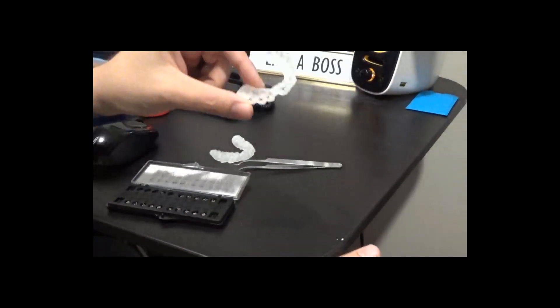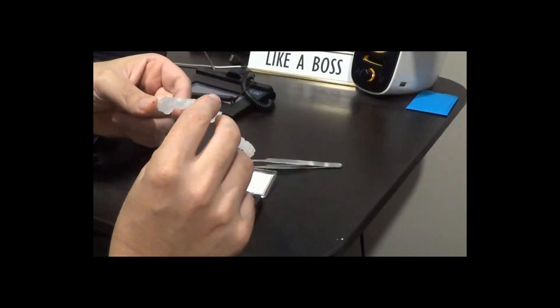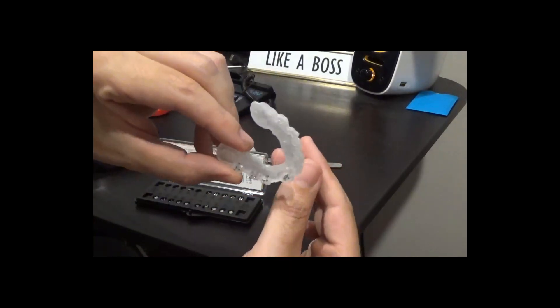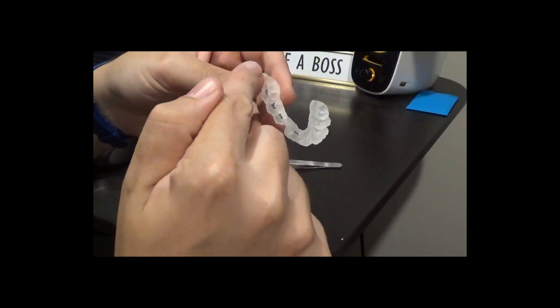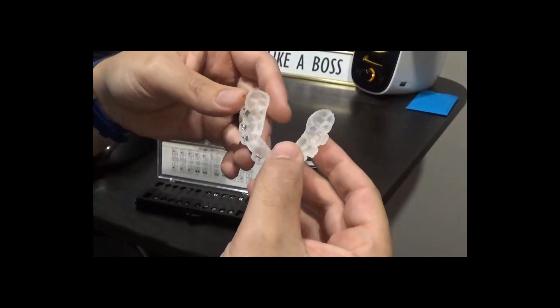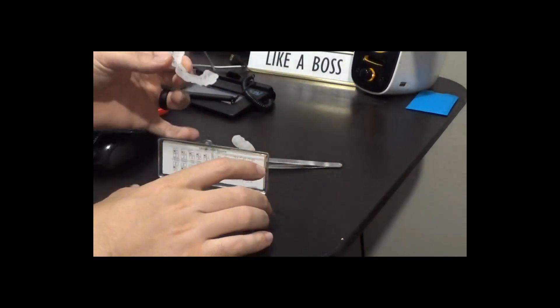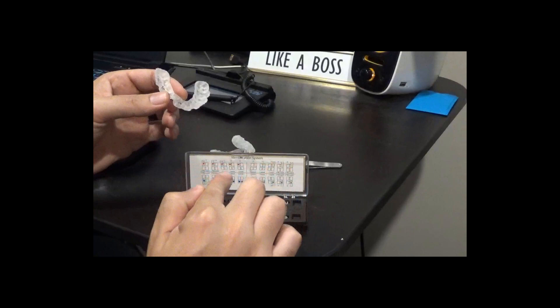Here is showing the upper right with the brackets in place. If you remember on the example video, number seven wasn't quite in yet, so that's why we don't have a bracket there. You can see the retention is pretty good. That's the big reason why I extended the border of the trays up over the brackets a lot more, because before I was having a problem with them wanting to roll out, but now it's pretty good. So if you're new to orthodontics with brackets, your identification dots are always going to be on the gingival.